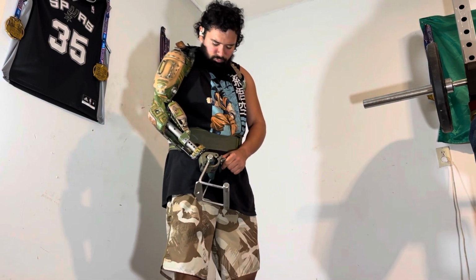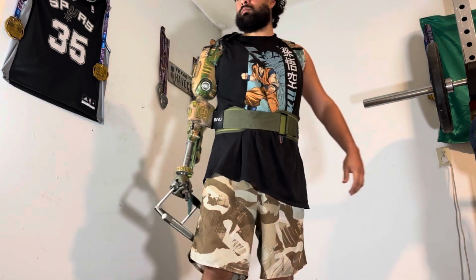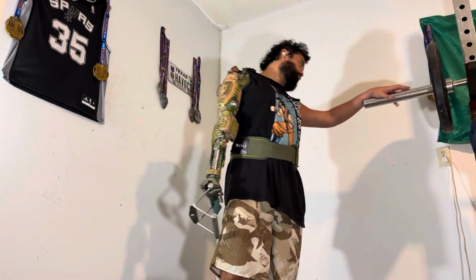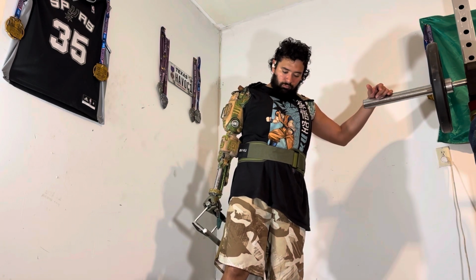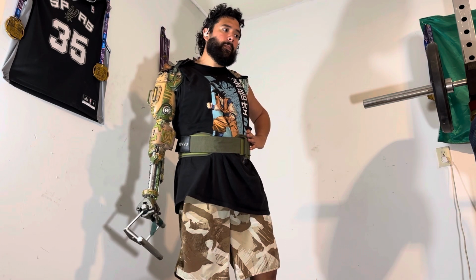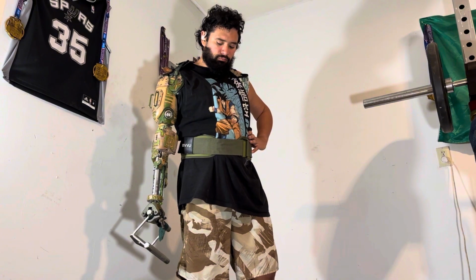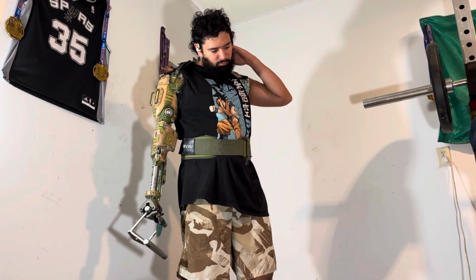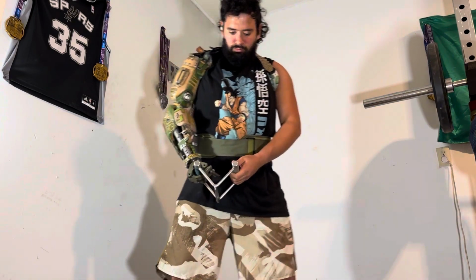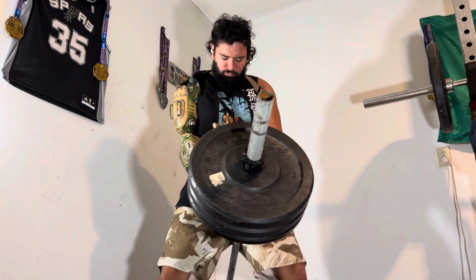And a lot of people confuse my arm for having a hydraulic actuator or hydraulic piston in it, but it's not that. But some people that I've talked to do believe that the motion that is required of an elbow is essentially the same as what is required of a linear actuator. And so for somebody like Tesla to get into prosthetics or robotics, they already have access to linear actuators, and that's not that far removed from prosthetic tech.